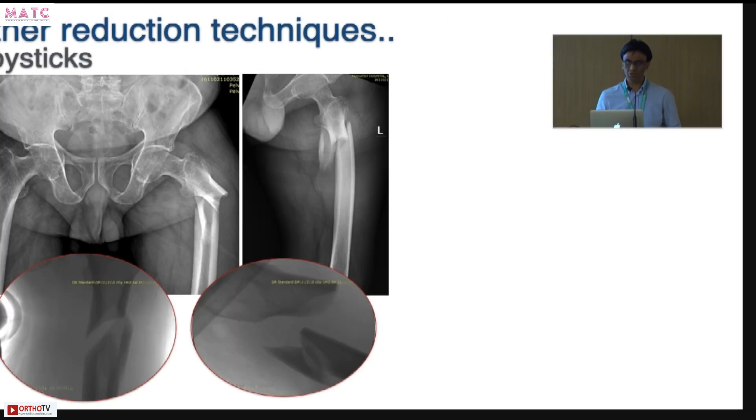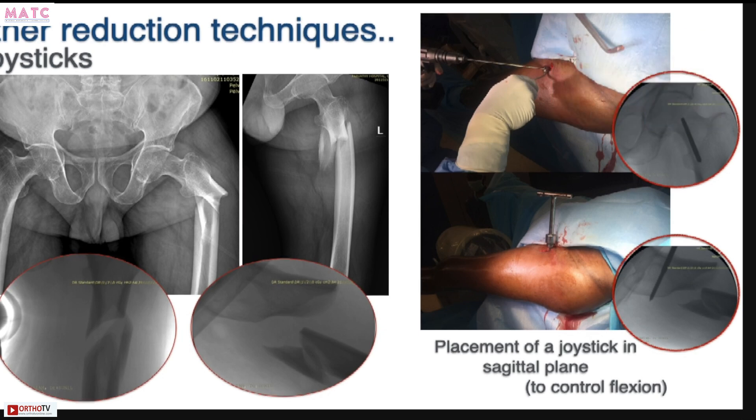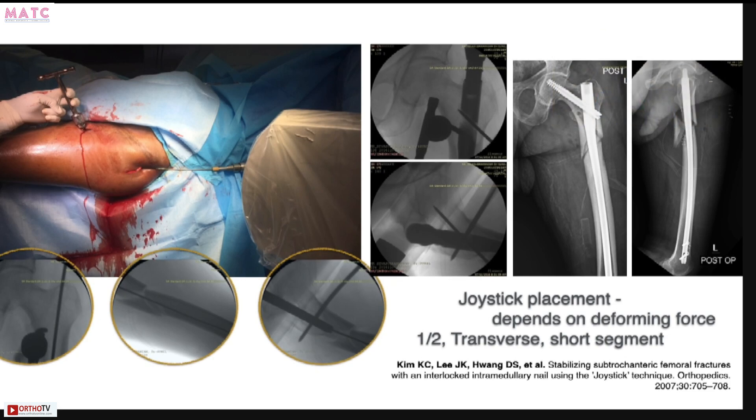Joysticks are great as well. I don't often use a joystick to control coronal fracture displacement because it sometimes comes in my way. However, if I have a large sagittal plane malalignment with good coronal plane alignment, I can place a joystick into the lesser trochanter — it doesn't interfere with my nail and helps to control flexion. Placement of joysticks depends on the deforming force you are trying to neutralize: for abduction, place it in the medial-lateral plane; for flexion, in the AP plane. I prefer joysticks for correcting sagittal plane deformity, and use other techniques for the coronal plane. They work very effectively in transverse fractures and short oblique fractures.